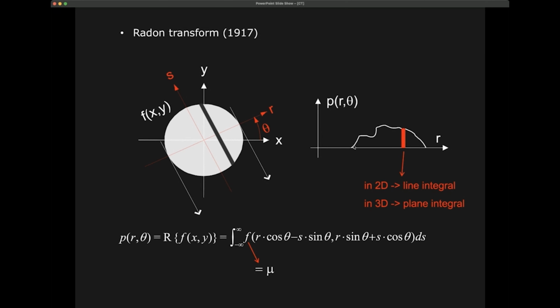So one of these projections, as we said before, is related to the attenuation, to the intensity that comes out after the X-ray passed through the body, and we can convert this into a grayscale. So instead of plotting it like this, the higher the amplitude, the whiter the pixel will be, and the lower the amplitude, and if it's 0, then it's black.